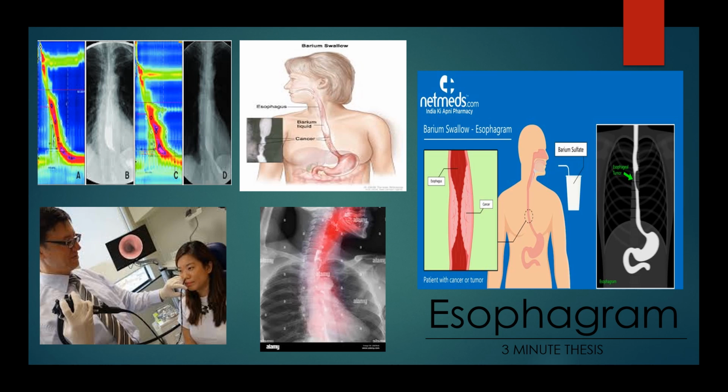High-resolution manometry (HRM) is a diagnostic technique that provides detailed information about the esophageal motility patterns and pressure dynamics. It involves the placement of a catheter with multiple pressure sensors along the length of the esophagus to measure intraluminal pressure changes during swallowing. HRM allows for the assessment of esophageal peristalsis, lower esophageal sphincter function, and the detection of motility disorders such as esophageal spasm or ineffective esophageal motility.